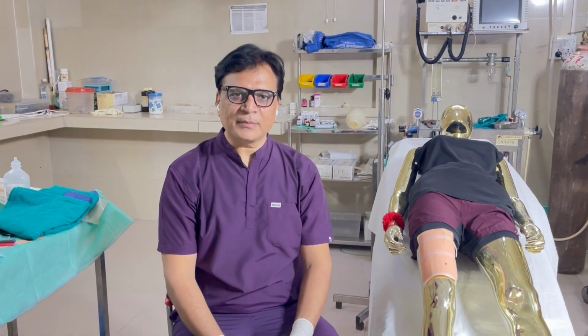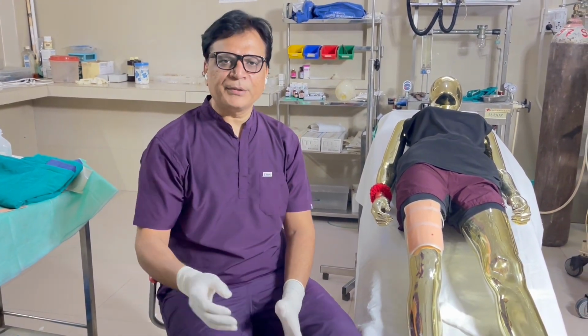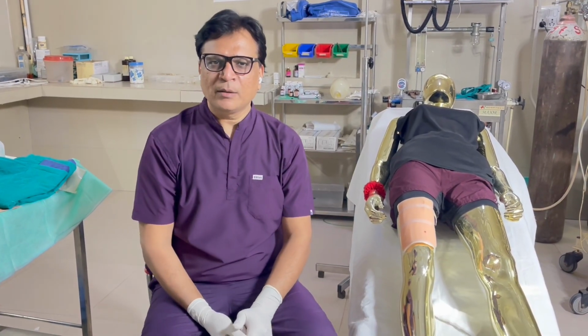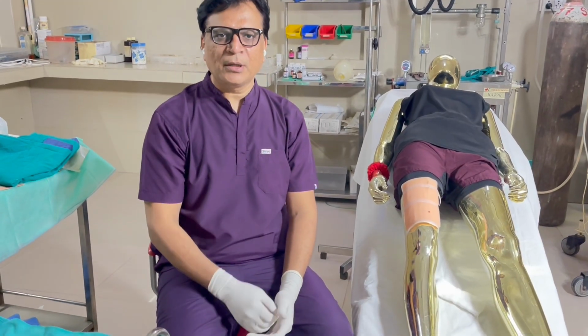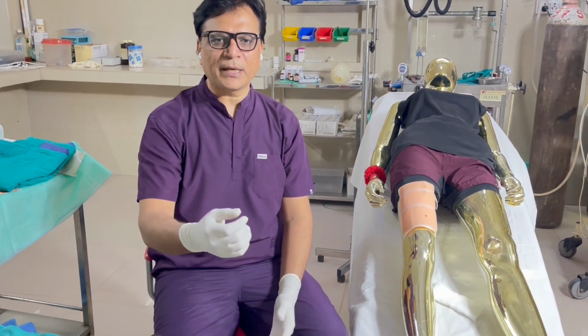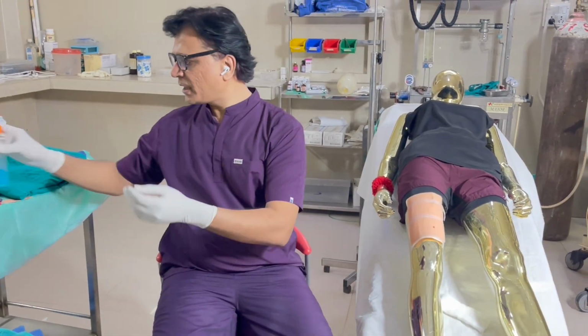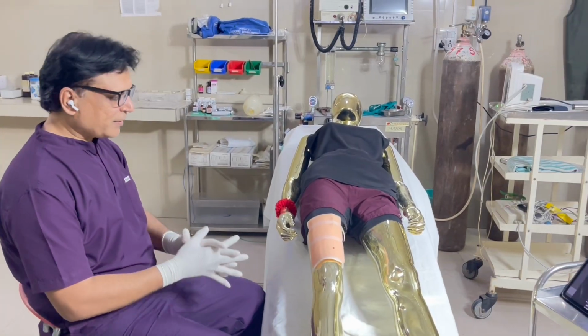So the next station is about a person having a nevus on the thigh. It is about a small mole, and I have to excise the mole under local anesthesia. So I enter the station, knock on the door, give my candidate number. Then I sanitize my hands, put on the gloves, then turn towards the patient.